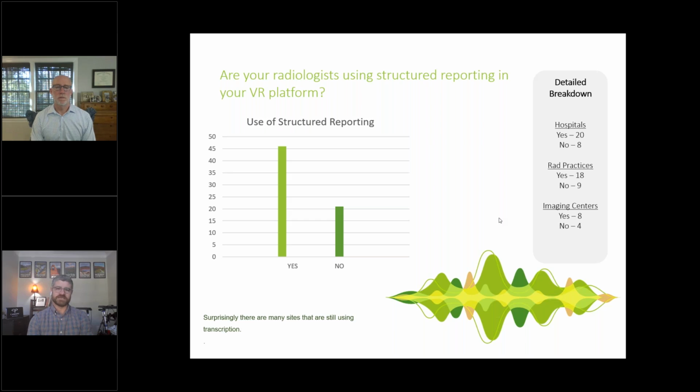And by that, I mean, we're seeing a good number of radiology groups as they continue to try to optimize radiologist time to focus on radiology report generation and not all that other stuff that can consume a radiologist's day. We're seeing some of the most progressive groups take literally everything out of the radiologist's hands except for opening up the study and dictating a result. And so with that in mind, on the front side, a lot of radiology groups have professional radiology assistants to get the study ready, especially high value imaging studies, have it hung perfectly, have all the priors there and prefetched from other places and good to go. So when the radiologist opens it, they can literally start dictating right then.